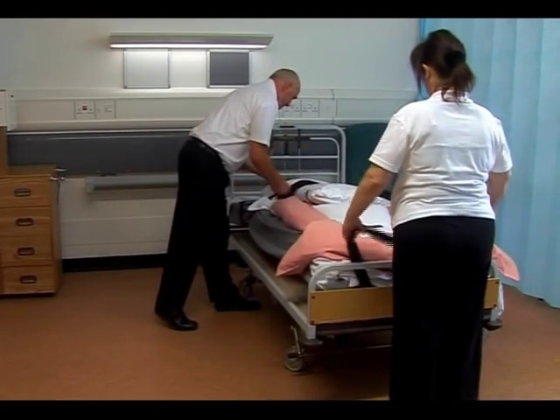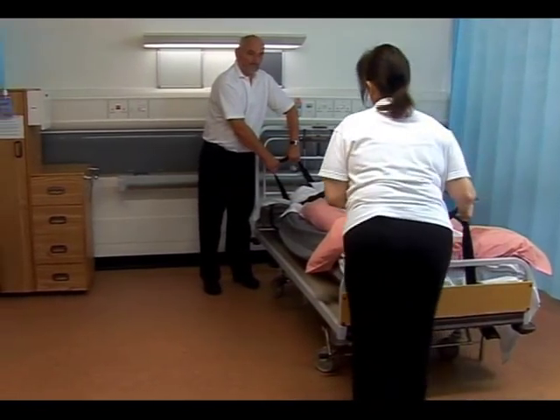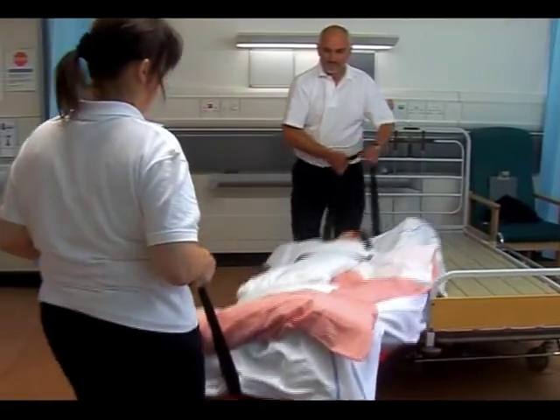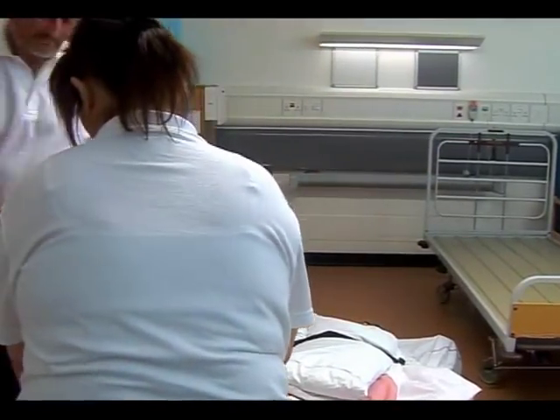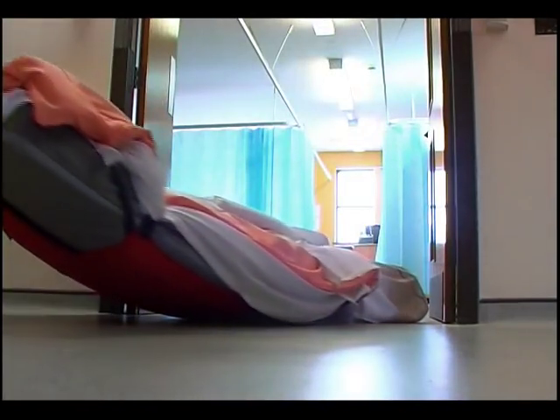Remove the pulling handles from beneath the mattress, ensuring that the bed is at its lowest position. It is usual for a count of three to take place before sliding the mattress to the floor. Taking the mattress off the side of the bed feet first is the most likely route to take due to lack of space and bedside furniture.